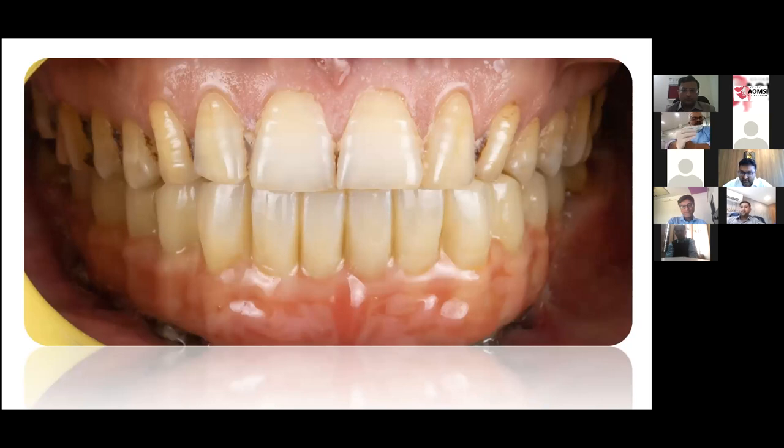So what I want to mention also one more thing, when we're talking about when the skin graft is there. I am getting the cases where already the fibula is there and I'm doing all flaplessly, I just keep one thing very simple. When I'm doing the resection cases or the mucormycosis cases, nowadays we are saying mucormycosis, otherwise we were all talking about the resection cases only. The one thing we should keep in mind, the abutment should have at least 3 millimeter of sanitary space from the tissue bed. So the abutment should be 3 millimeter away from the tissue.